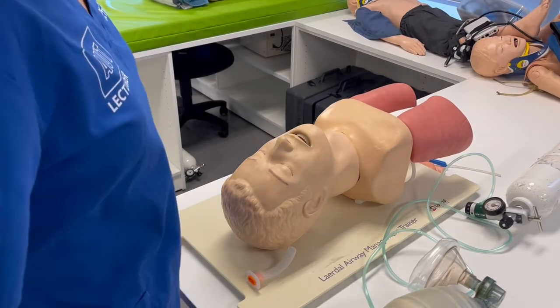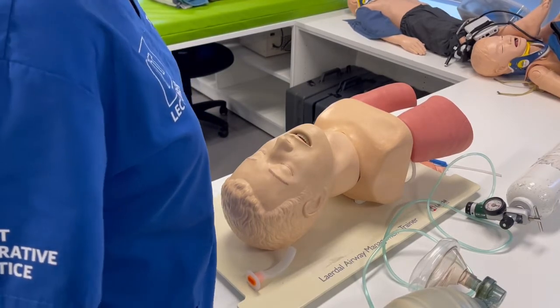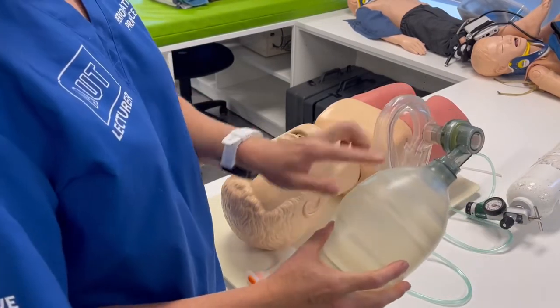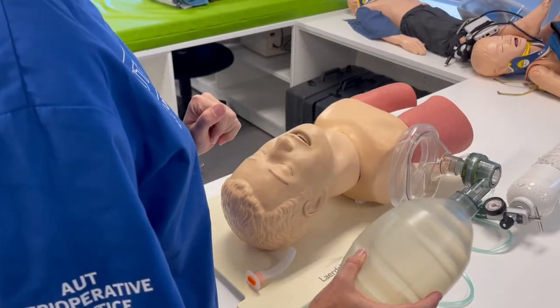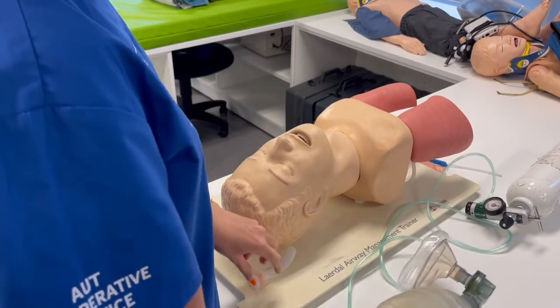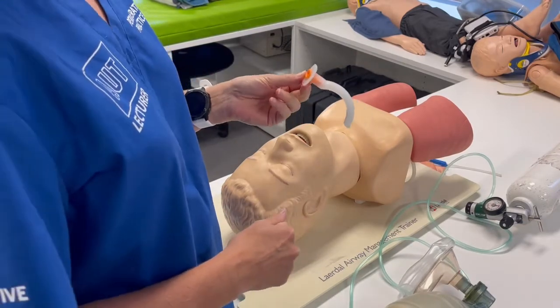In order to provide bag mask ventilation, you would use a bag valve mask, also called an ambu bag or resuscitation device. You would have an airway adjunct in situ — that could be an oral or a nasal airway.